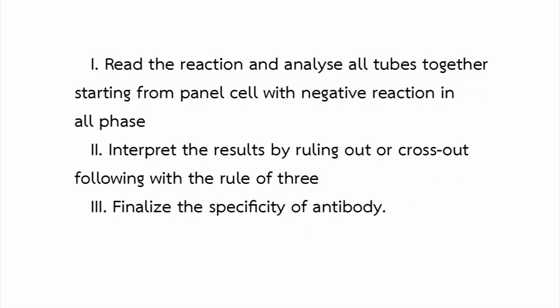Read the reactions and analyze all tubes together, starting from panel cells with negative reaction in all phases. Interpret the results by ruling out or crossing out, following the rule of 3. Finalize the specificity of the antibody.